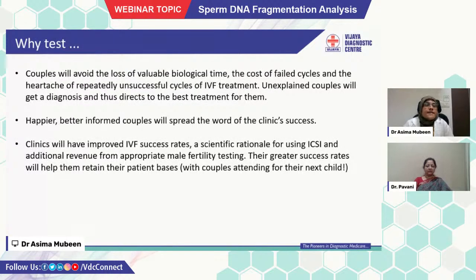Now, why test this? The couples will avoid the loss of valuable biological time, the cost of failed cycles, and the heartache of repeatedly unsuccessful cycles of IVF treatment. Unexplained couples will get a diagnosis and thus be directed to the best treatment for them.